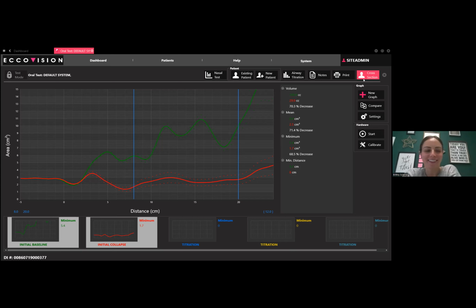Aren't we all? And they're not on the level of an actual sleep apnea test, but I think it's a good coachable device. I think it gives us good information to know what are our habits that are influencing our sleep. Do we have a routine bedtime? Are we going to bed at the same time getting up? Do we have caffeine too late in the day? Maybe we shouldn't have had that extra drink, or the late meal, or exercise in the evening. All the things that we think of.